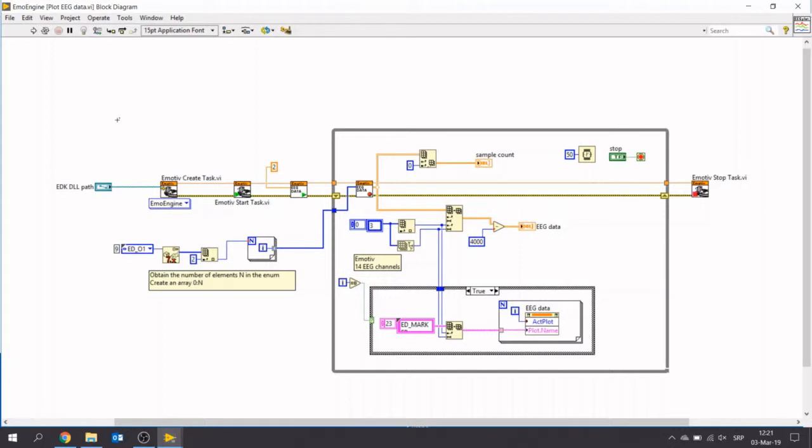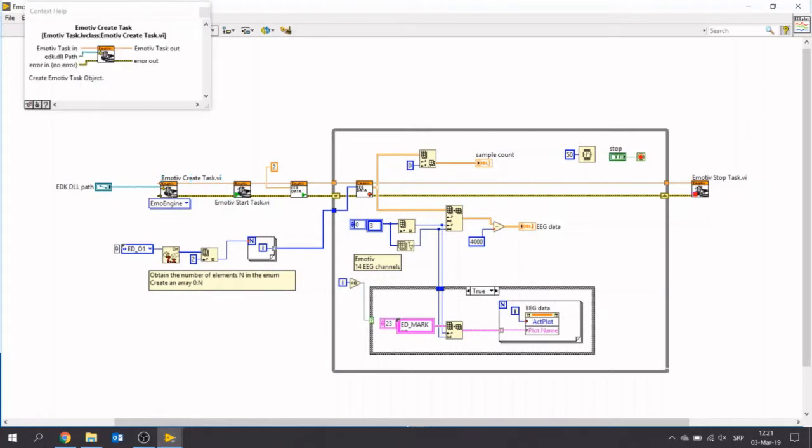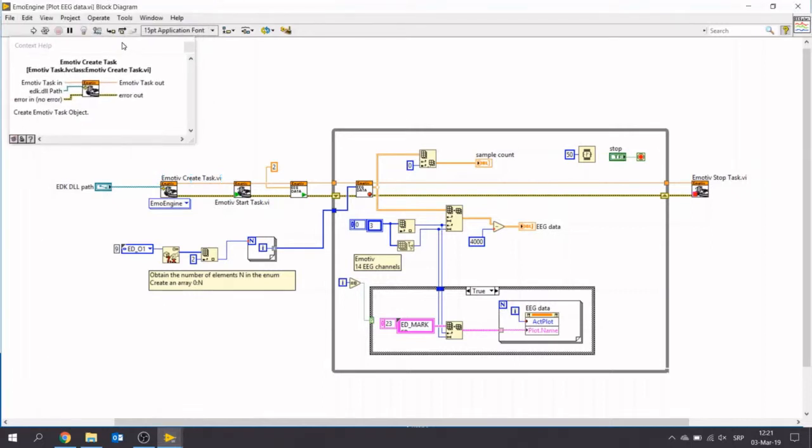Only the blocks are called a little bit different, and the stuff in the while loop is a little bit different. So first, we have this create task for Emotiv. I'm going to open the context help so we can also see that there. And as its input, we have to specify which EDK DLL file we are going to use. So we have a control to insert the path to this EDK DLL file.